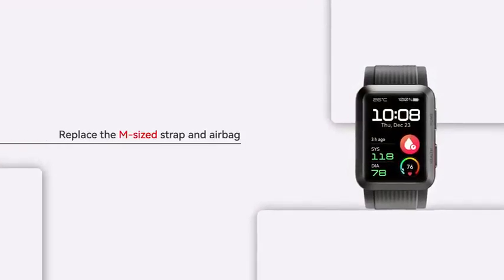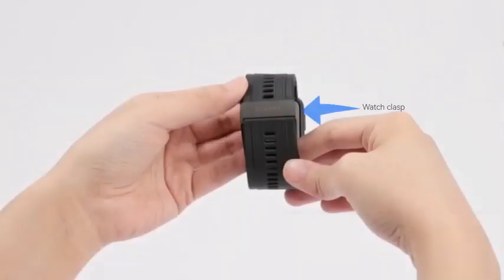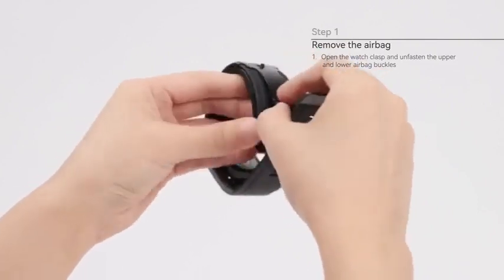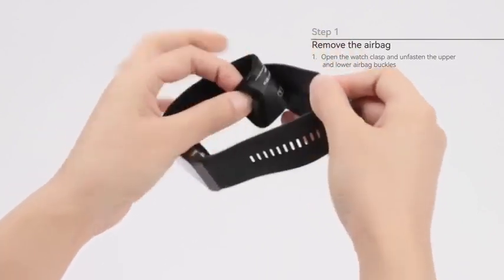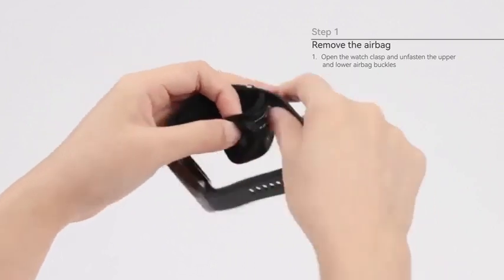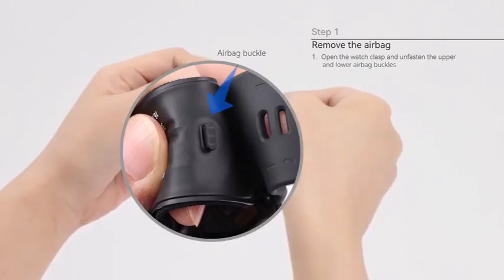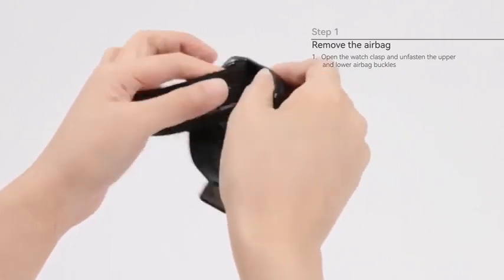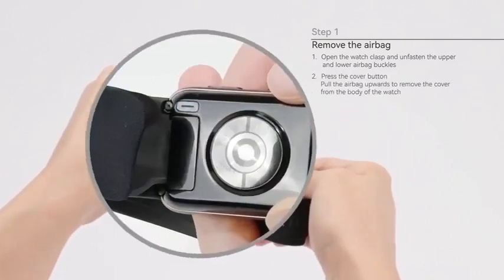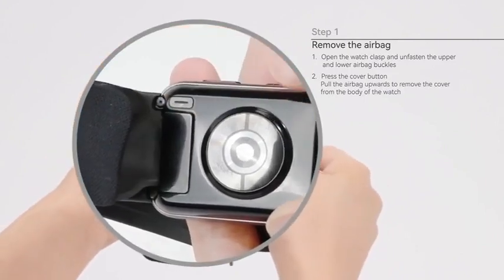Replace the M sized strap and airbag. Step 1: Remove the airbag. Open the watch clasp and unfasten the upper and lower airbag buckles. Press the cover button and pull the airbag upwards to remove the cover from the body of the watch.